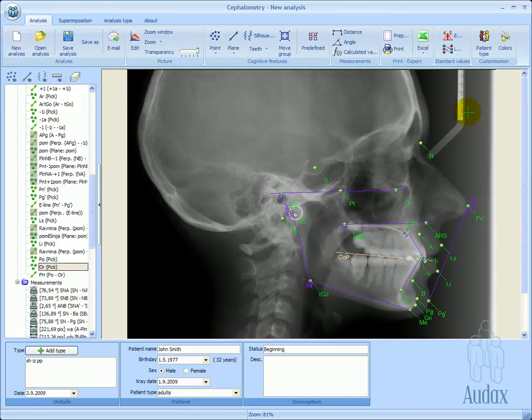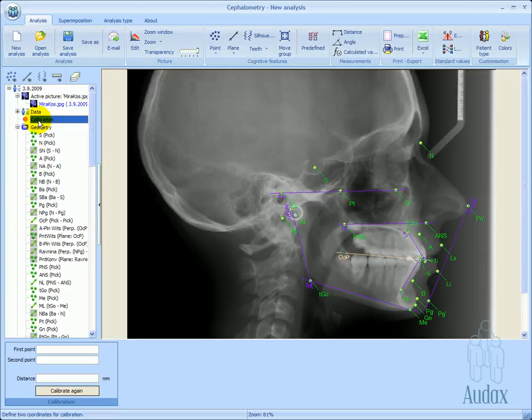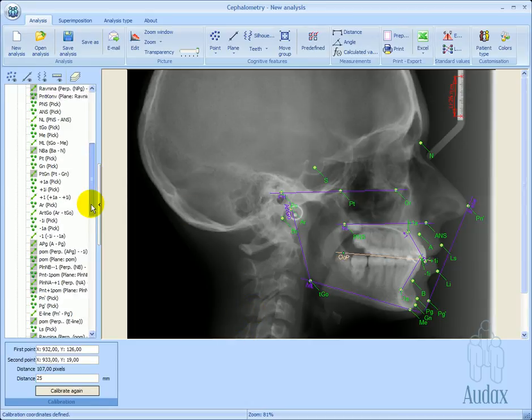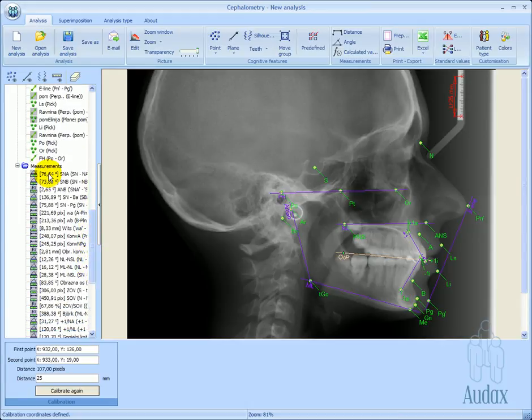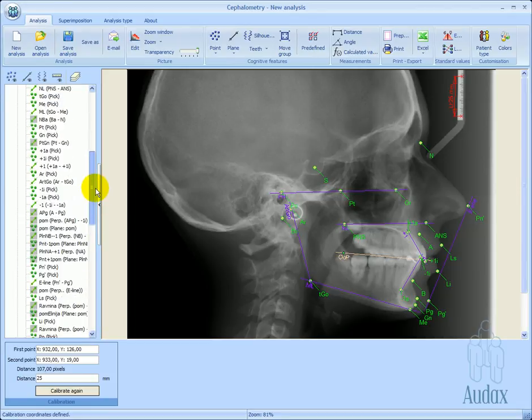After all the elements have been moved to their correct positions, we need to calibrate the image. Let's select the measuring scale and choose the calibration element. Based on the selected distance on the scale, we enter the correct millimeter count into the distance field. As we can see, all the measurements now have the appropriate units.